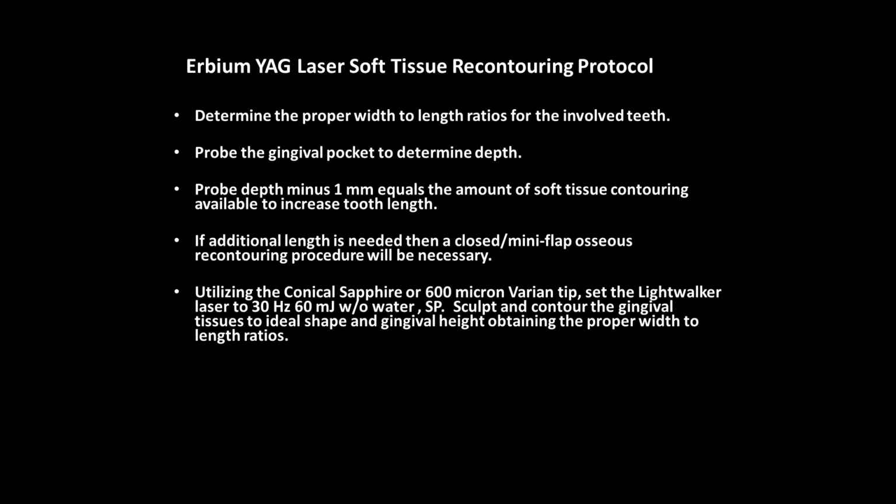I like the conical sapphire tip. You can use a 600 micron Varian tip. Lightwalker settings: 30 hertz, 60 millijoules, starting without water, because you get a better contour and you get better results.